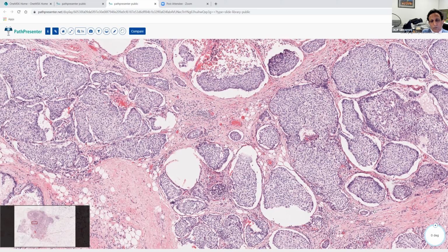Oh, well, if you have a good layer of myoepithelial cells, then of course this is unlikely to be invasive. I doubt very much that in the situation that we saw here, the myoepithelial cells will be present in those nests.